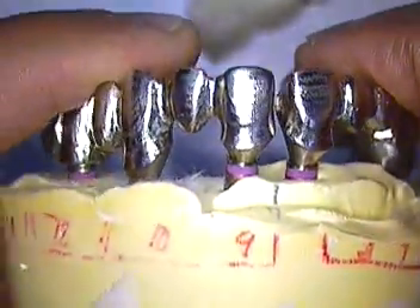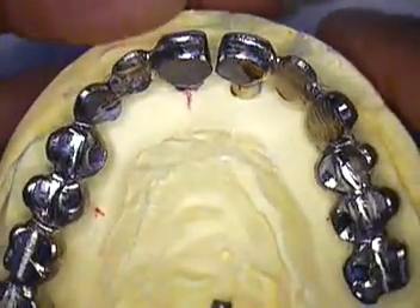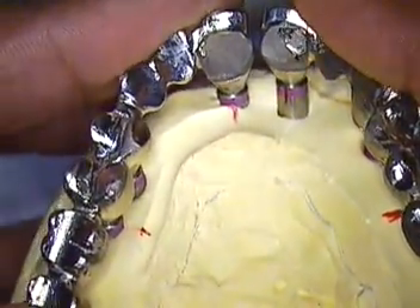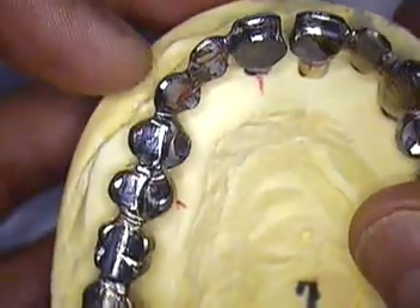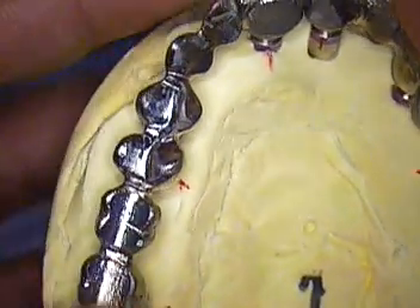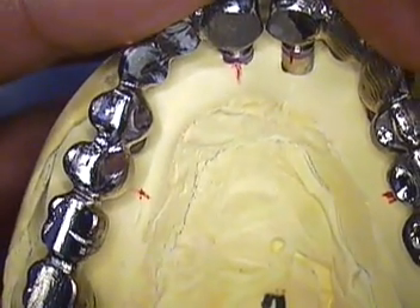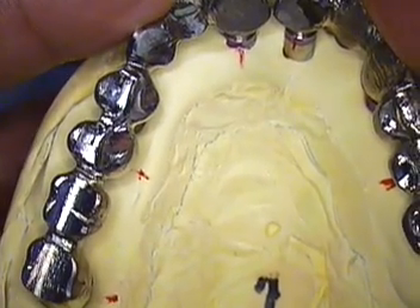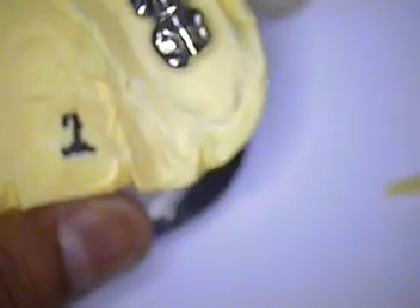Ken is looking forward to this appointment. He's got, I believe, two more after today if all goes well, and then he's on his way back up to Illinois to spend time there in the summer. We now have our frames ready, and the next step is to try them in the mouth and verify fit. You can email us at mailbox@gcuomodds.com, visit our website at www.gcuomodds.com, or call us at 561-391-6290. Thank you and take care — see you on the next segment.